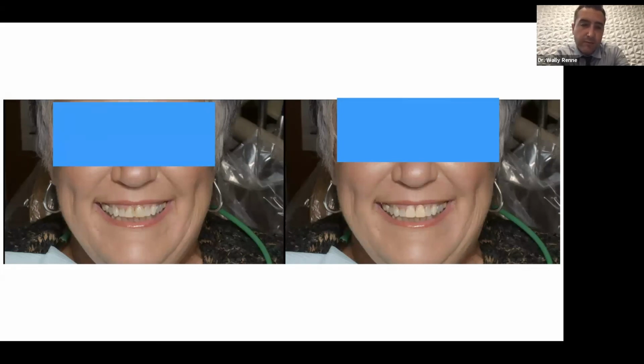And so I humored her. I said, okay, yeah, we could do 2 veneers there. No problem. But before we start shaving down your healthy tooth structure, let's take a look at what it would look like. And so I mocked up 2 veneers in Romexis Smile Design on 8 and 9. And she looks at them and she's like, why are they dark like the rest of my teeth? And I said, well, we're just doing 2 veneers, so we can't brighten them, because if we brighten them, you're going to have 2 fluorescent teeth in the front. And so I actually used a slider that I'm going to show you guys and brightened them up. And she's like, oh, that's terrible. They look so fake and funny.